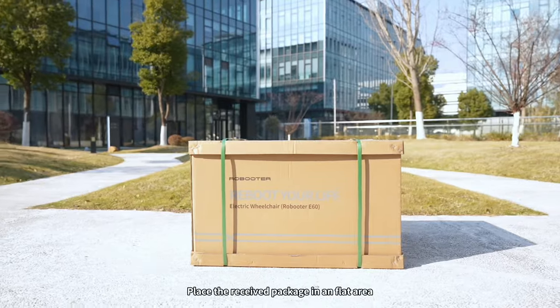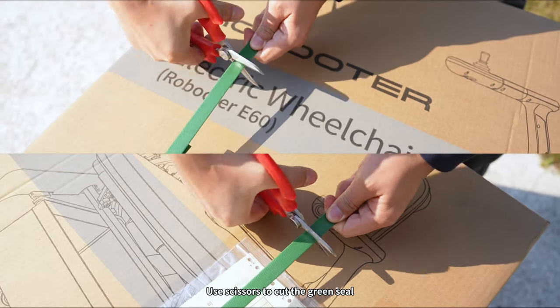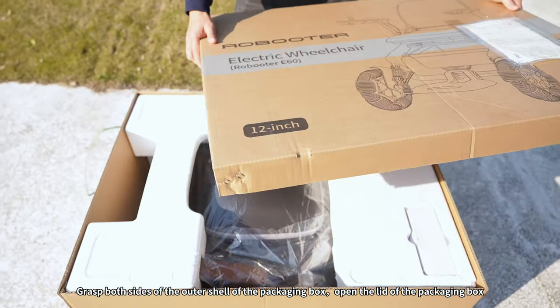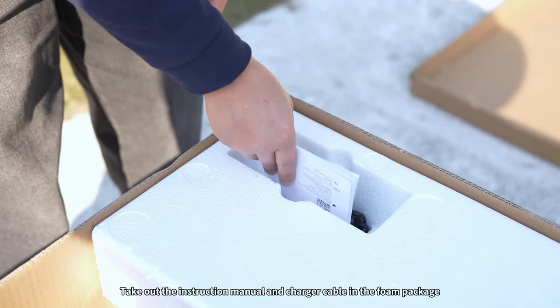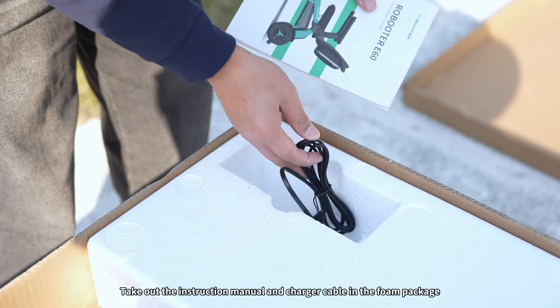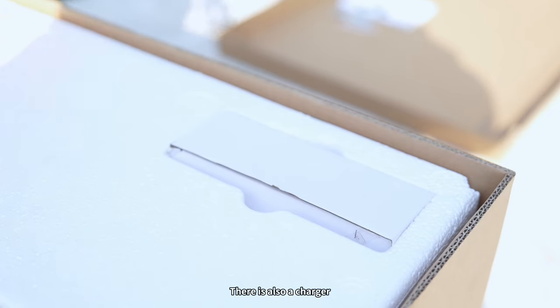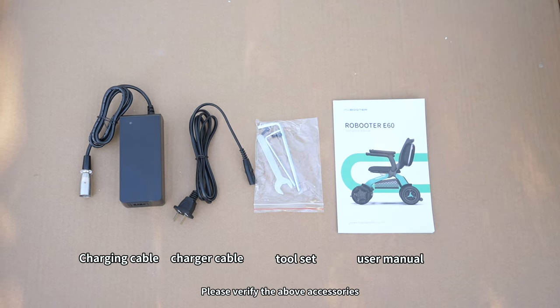Place the received package on a flat area. Use scissors to cut the green seal. Grasp both sides of the outer shell of the packaging box and open the lid. Take out the instruction manual and charger cable in the foam package. There is also a charger. Please verify the above accessories.